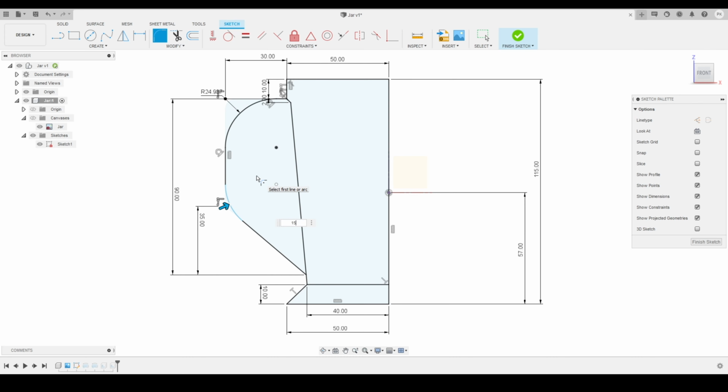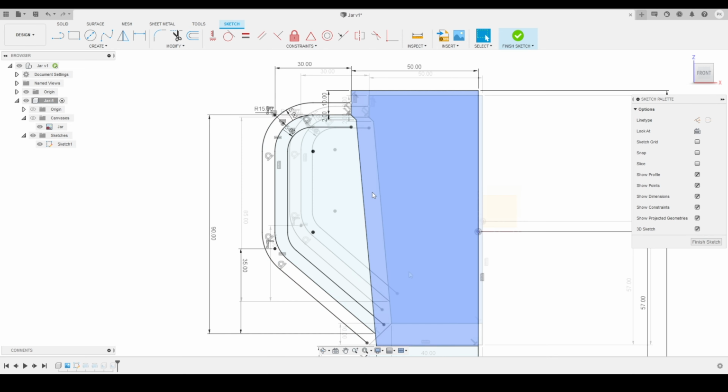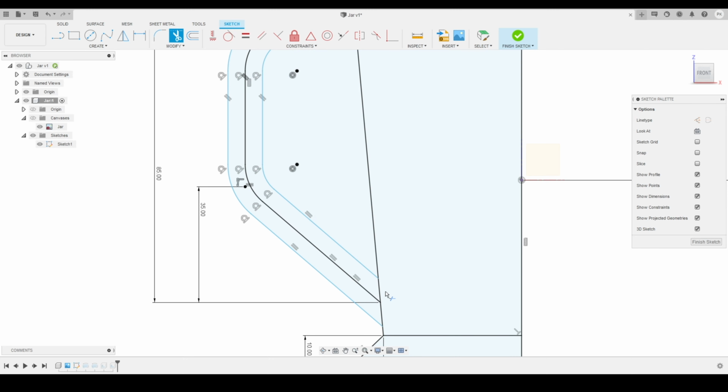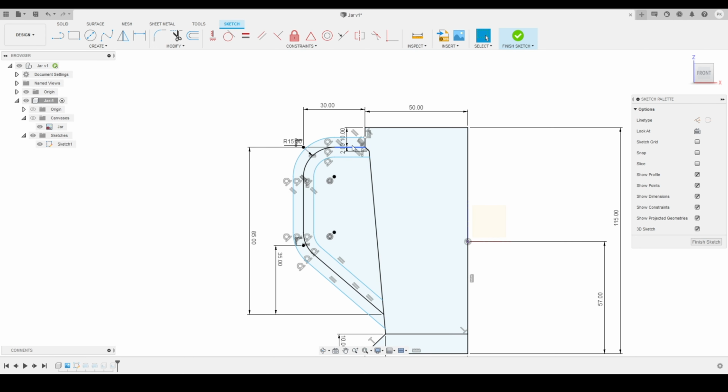And now we are going to activate our offset tool again, and we'll offset this handle shape towards inside by 5 millimeter, and we'll repeat the offset tool again, and we'll select the profile and offset it towards outside. Here you can see by 5 millimeter. Now I will go into the modify panel, activate the extend tool and extend the profiles to match with the edge of our jar. Here you can see, and now I will activate the trim tool and trim down the extra area.